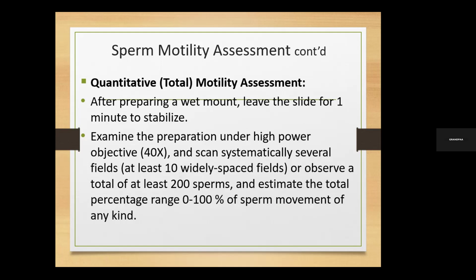Remember we said that once you get a sample, you are also obliged to prepare an initial wet mount, which you have done extensively. That same one can be used to assess your motility. It can also give an estimate of the dilution to make. It can also be used to find out whether there are some aggregates or mucus strands in there, and so forth and so on.